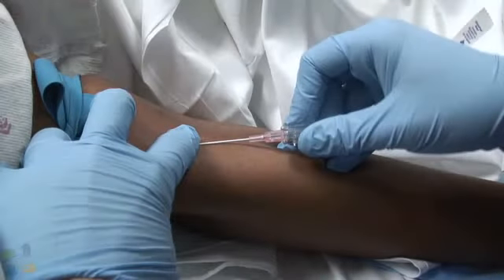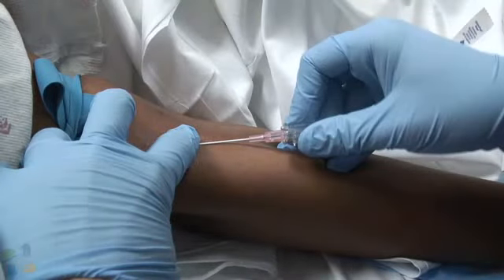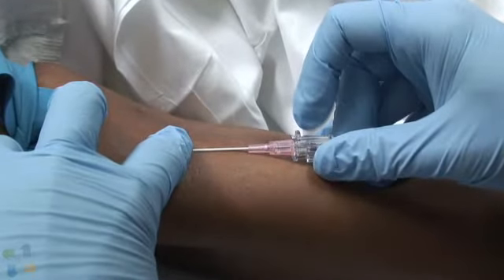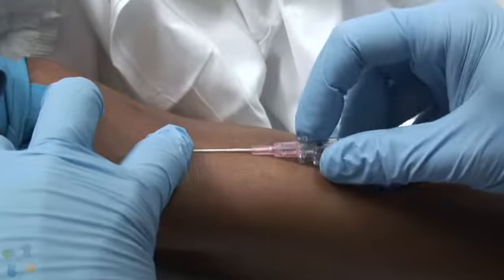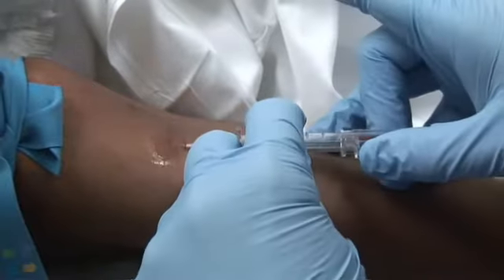Once the flash of blood is seen, flatten the angle of the needle and advance 1 to 2 millimeters to ensure that the needle tip is fully within the vessel. While holding the needle still, slide the catheter over the needle and into the vein.